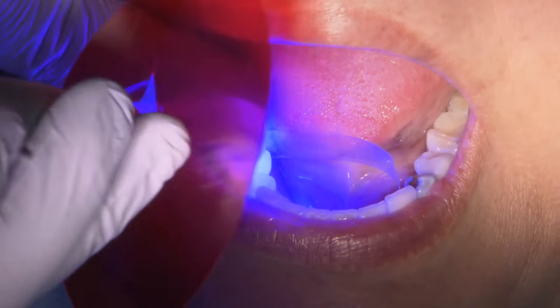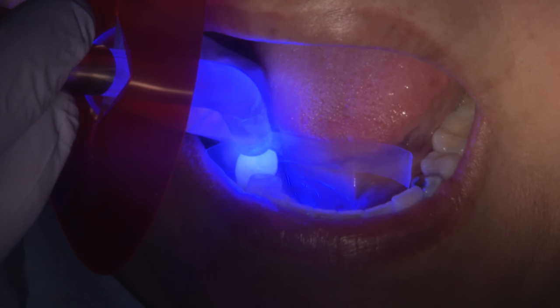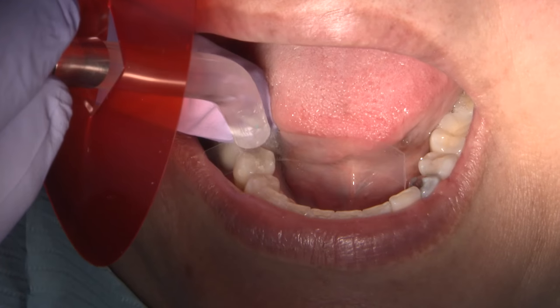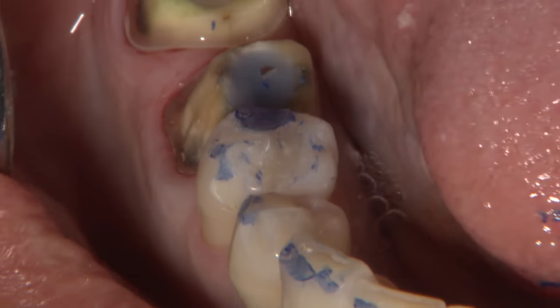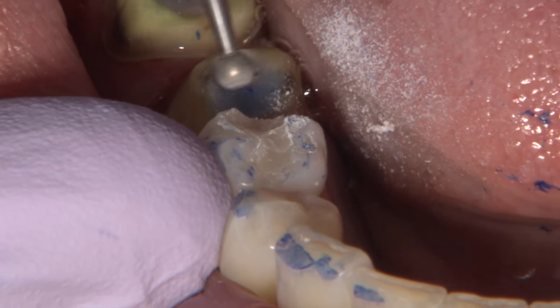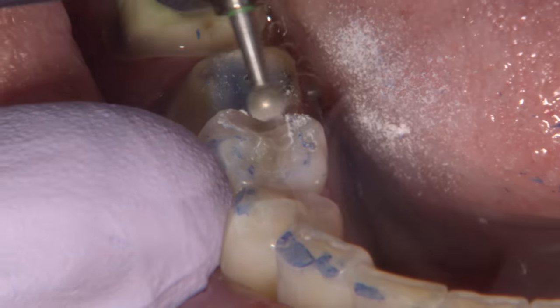Fermit is a light curing paste. It can be applied without additional application of temporary cement, and it is particularly suitable for deep inlay preparations with parallel walls. We cure the Fermit with the Biotemp in place to provide good distal contact. After curing, this material will have low elasticity and it will provide good retention for our temporary inlay. It can be easily adjusted for occlusion using a fine diamond on a slow speed.